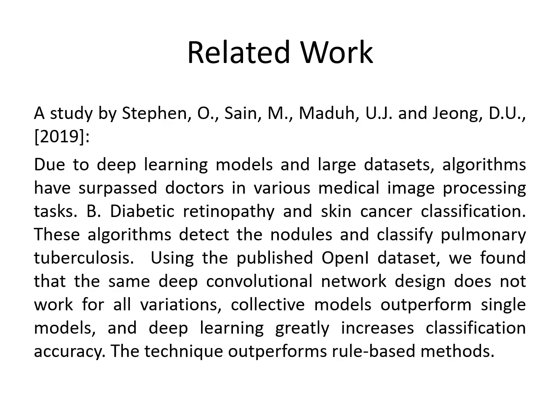We have taken this research paper under consideration to prove the efficiency of our investigation. In the study from 2019, the authors have a similar approach to ours. They trained their model on 3,722 X-ray images of anterior and posterior chests of retrospective pediatric patients between 1 to 5 years of age, producing a validation accuracy of approximately 94% with a minimal training loss of 0.1835.